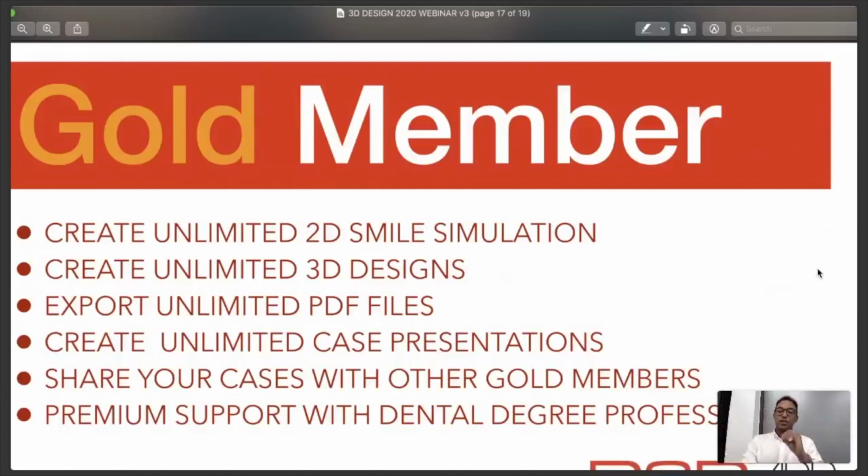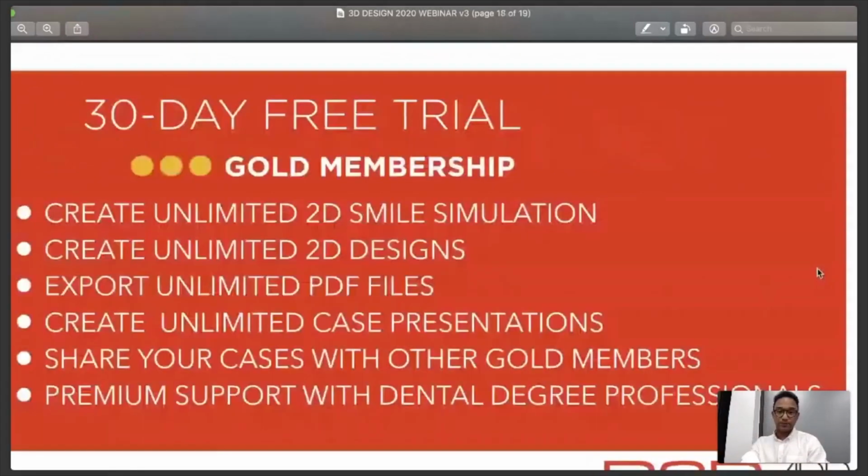And you can have premium support with dental degree professionals. We have dentists from all over the globe that work for the GSD app. They have different specialties, so we can always speak the same language, and we can help you design your 2D and 3D facially driven smile designs.